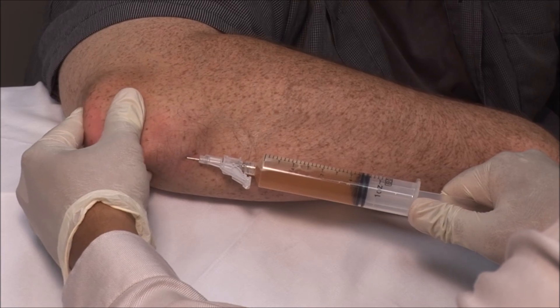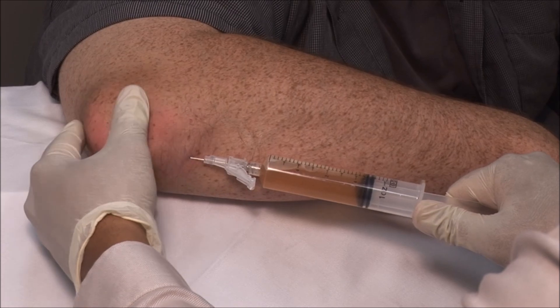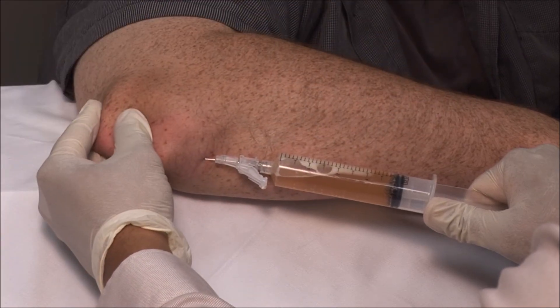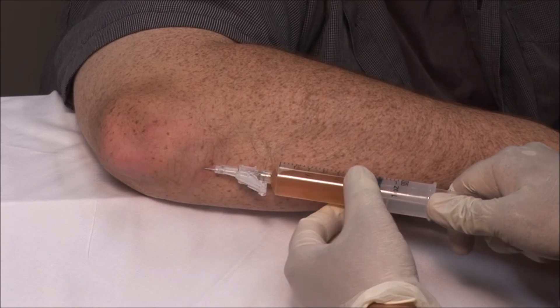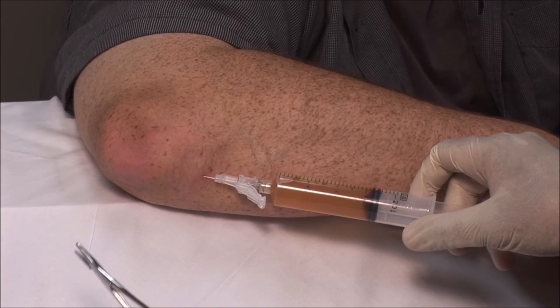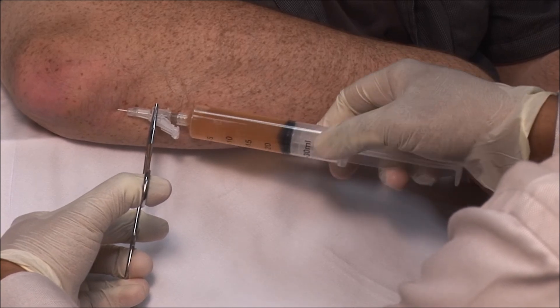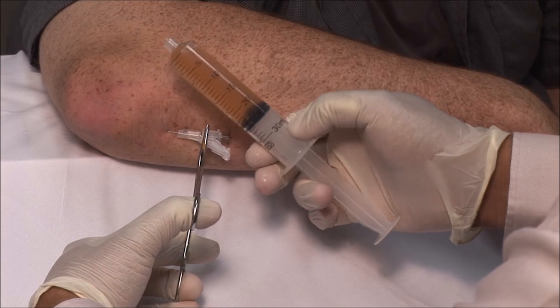I am not expecting the swelling to completely disappear as the bursa is full of tophi. Using forceps, stabilize the needle and switch syringes. I have obtained about 24 cc's of fluid.